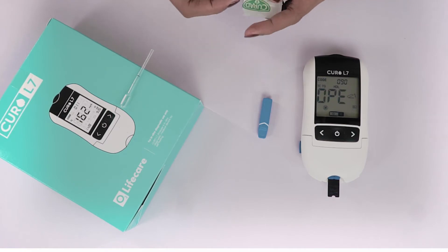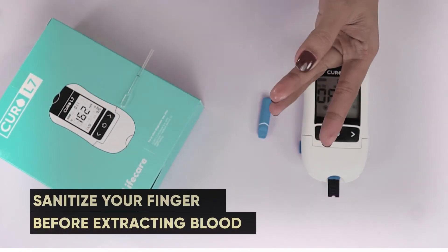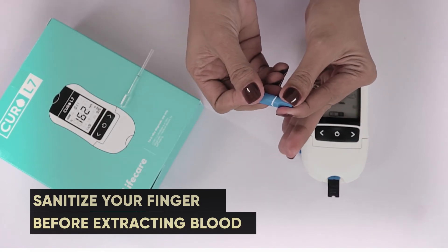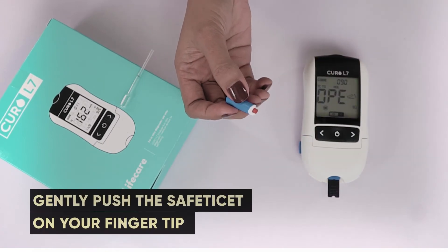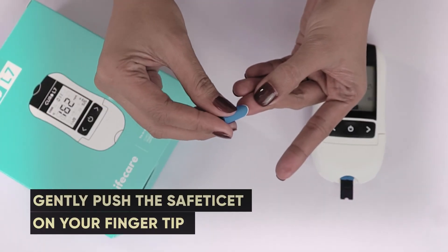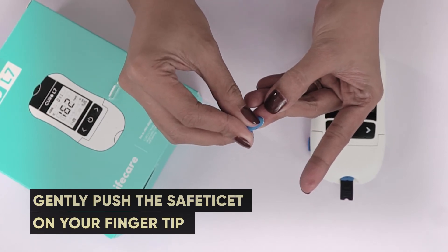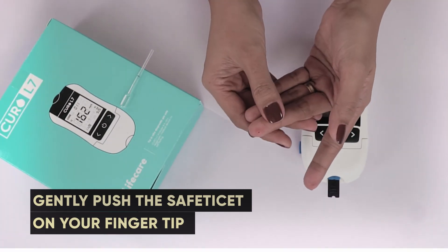Next, make sure you properly sanitize your finger before extracting blood using the safety lancet. Squeeze your finger, but not too much. Remove the protective cap of the safety lancet, then place the red end of the safety lancet on the fingertip. Then gently push the safety lancet against your fingertip to activate the safety lancet mechanism.